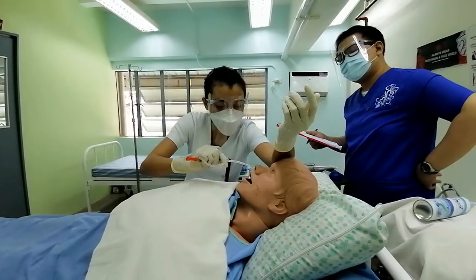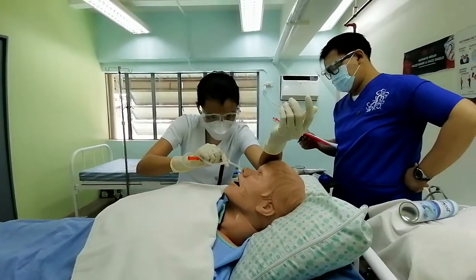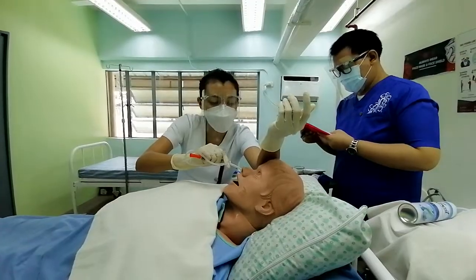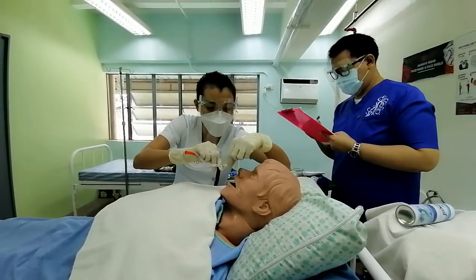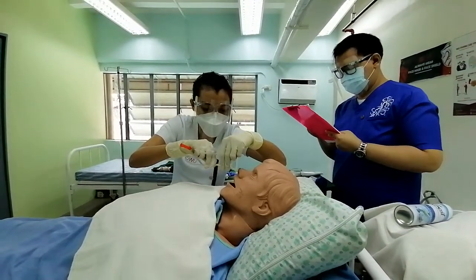If there is resistance, encourage the patient to flex the head forward in order to facilitate further insertion of the tube. And then allow the patient to swallow with me, sir, as I insert, because swallowing also facilitates insertion.